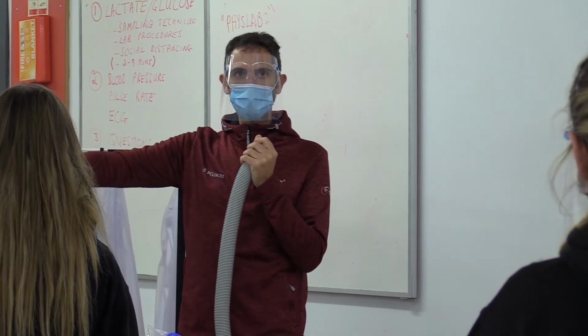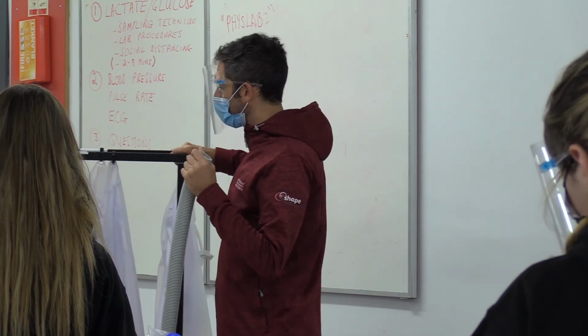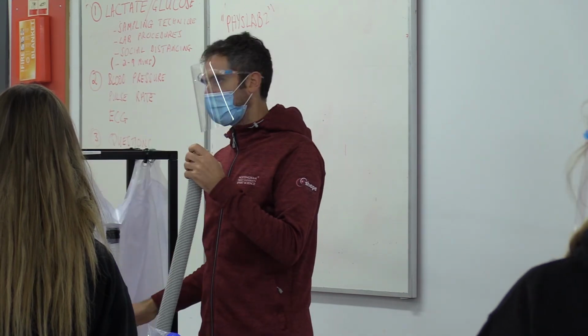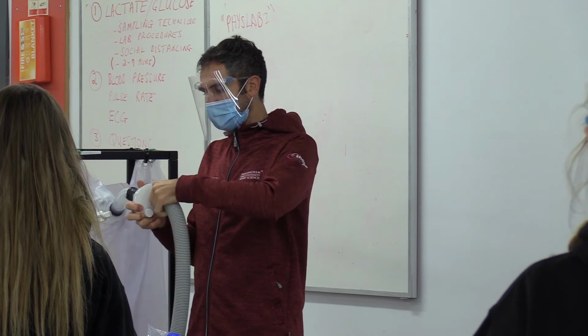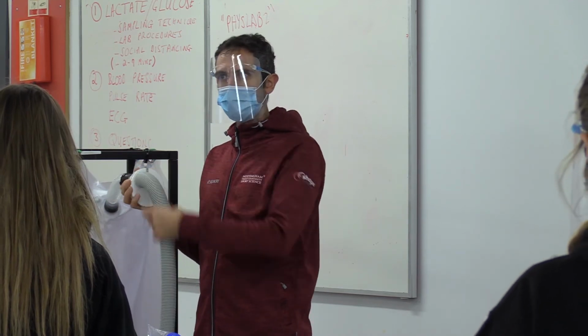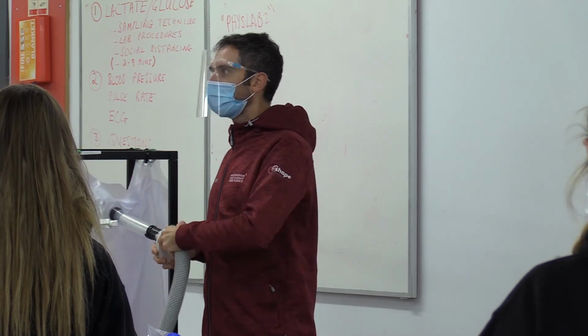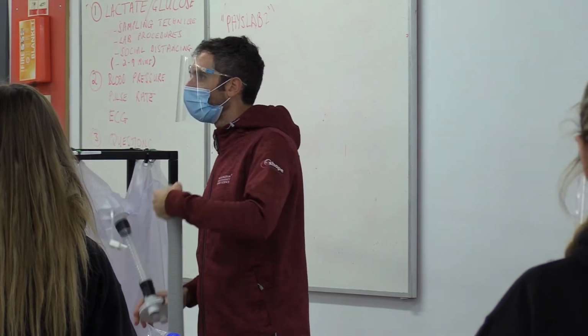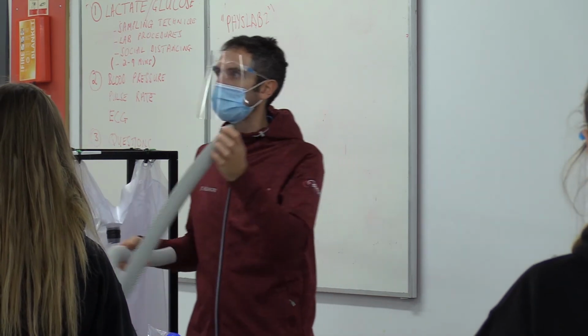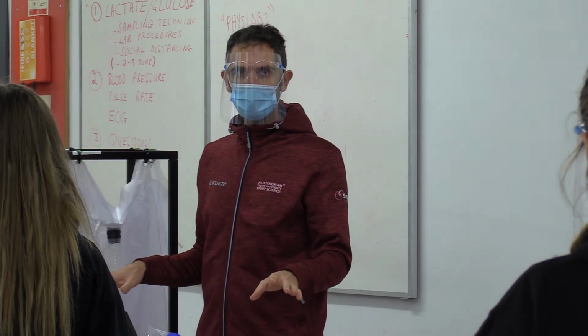We have more weight on the basket, on the bikes, I'll show you that in a second. So we increase the intensity, we go on to the next bag, then on 2 minutes at the second stage, ready to collect the air again, we turn the valve, and it goes into the bag. Okay? So we do 4 3-minute stages, all with an increase in intensity as we go along. Okay? Is that clear for everybody?